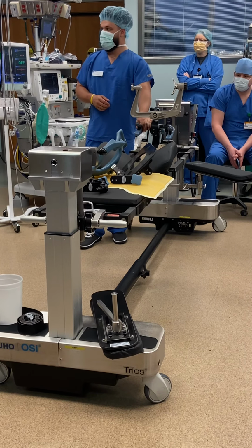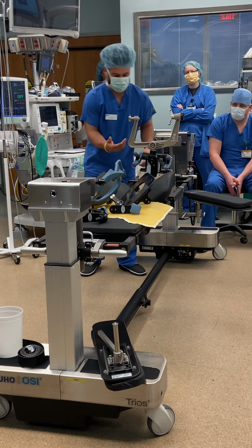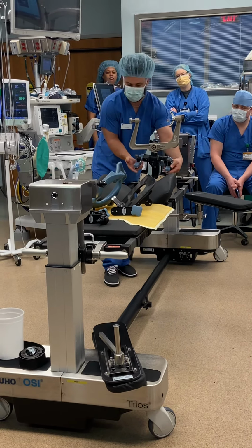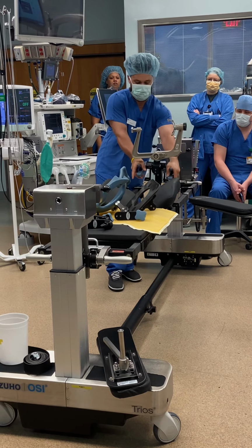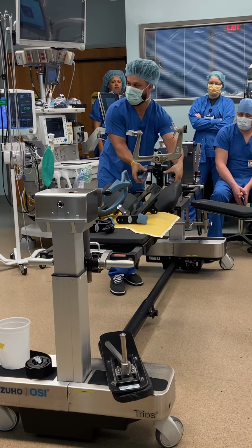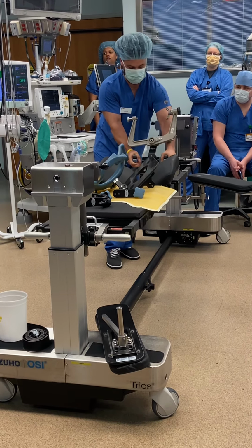Can you explain more how to adjust it, position-wise, like which buttons and handles to press? Yeah, absolutely. You're going to grab it with both your right and your left hand. There are two little triggers on the bottom. When you see the ones at the top, you think, oh, I can't move it. You have to actually hit these underneath. Then that's when you're able to squeeze with your top hand and position it the way you'd like.